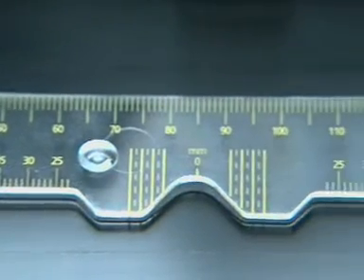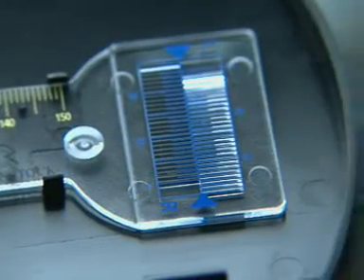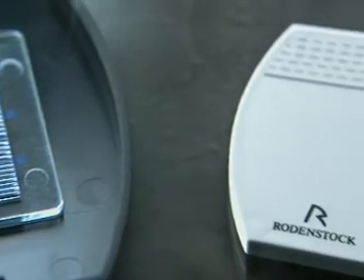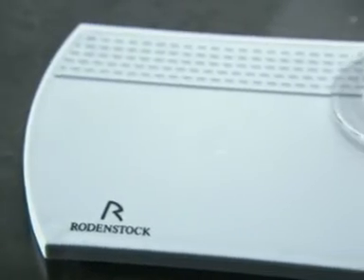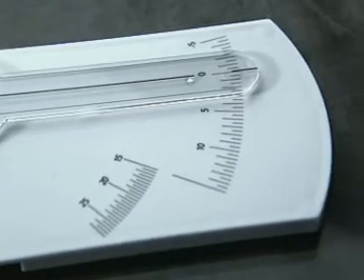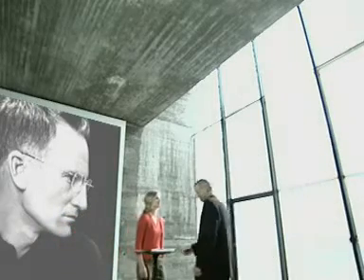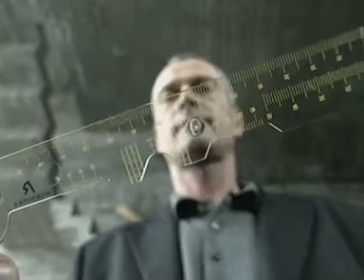The values can be determined very easily using the CVD ruler and the specially developed measuring device for the dihedral angle. The monocular interpupillary distance is often measured with a PD meter or a video fitting system. The combination tool, however, can also be used to measure the PD simply and quickly.